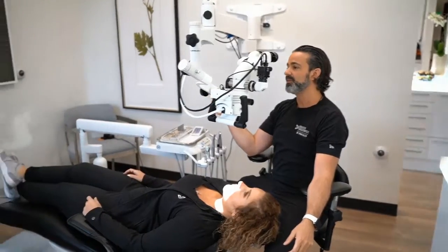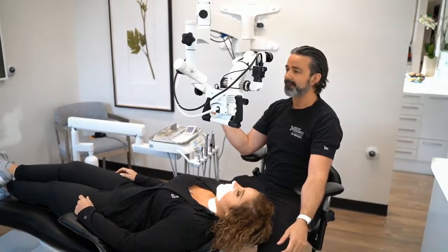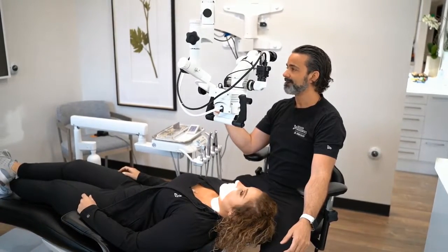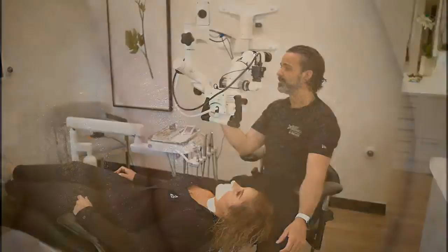Do you want to do the intraoral view? Maybe on the laptop, hit the second one, intraoral, picture in picture. There you go.